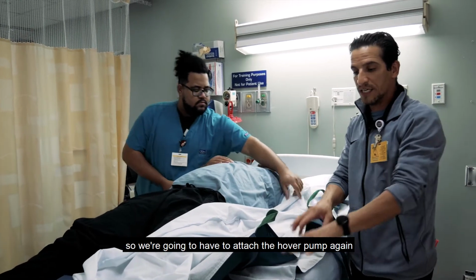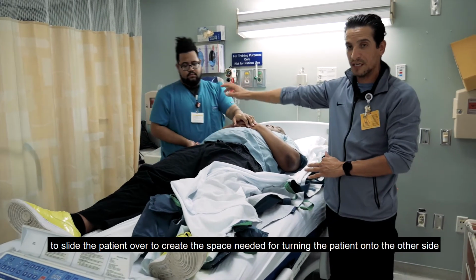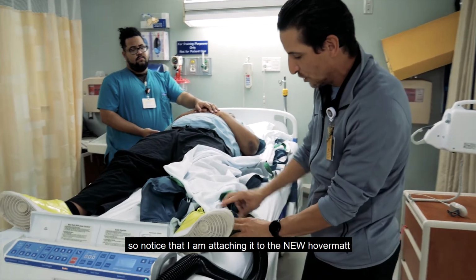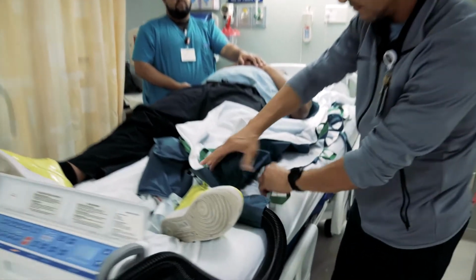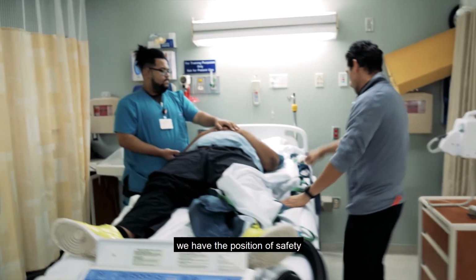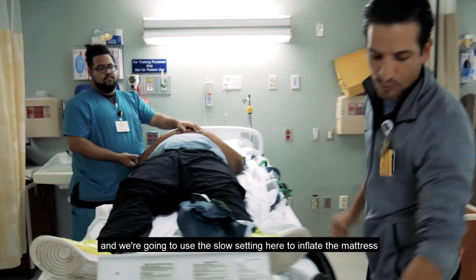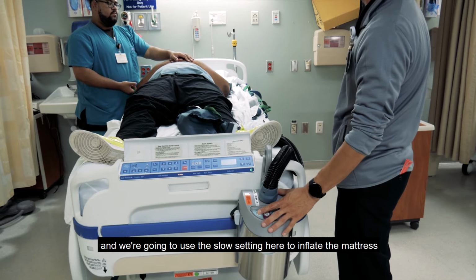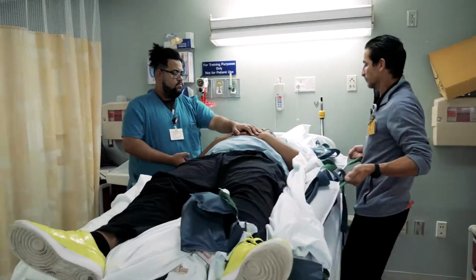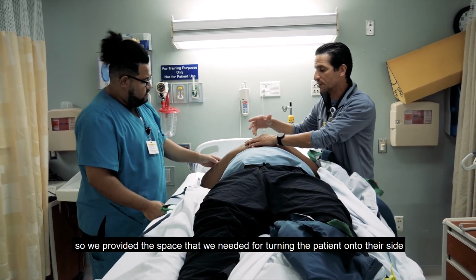So we're going to have to attach the hover pump again to slide the patient over to create the space needed for turning the patient onto the other side. So notice that I am attaching it to the new hover mat. Not the old one, the new one. We have the position of safety, stop, lock, and look. Make sure we have slack on all the lines and everything. And we're going to use the slow setting here to inflate the mattress. Excellent. So we provided the space that we needed for turning the patient onto their side.